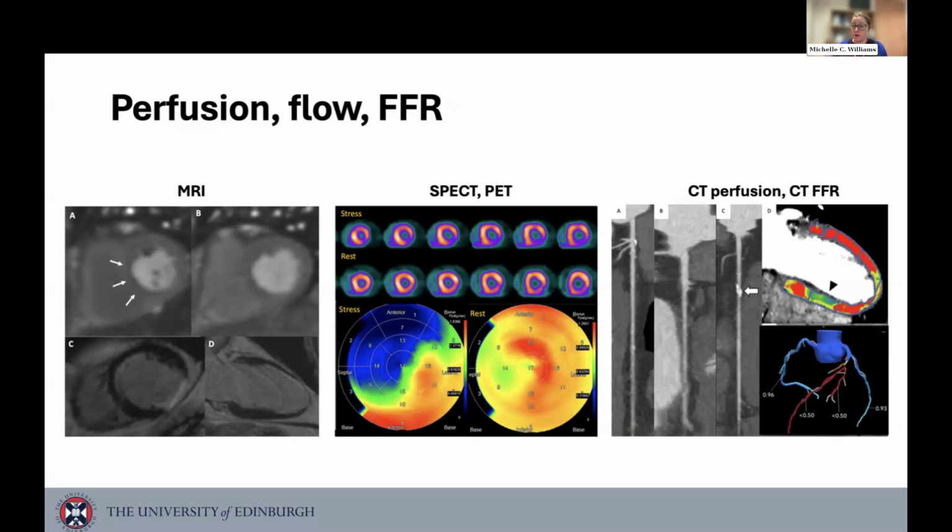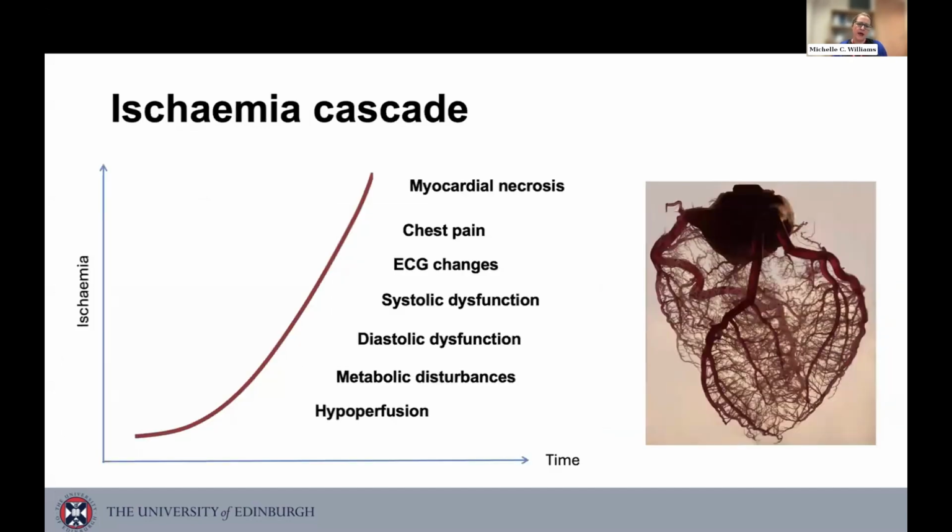We've got CT myocardial perfusion imaging and CT FFR. So in the last few minutes, there's a lot to talk about there. I'm not going to cover all of these things, but I'm going to talk about some general overview pictures. The first is going to be perfusion imaging, and I'm going to focus in on CT perfusion because I've done a lot of work on that over the years.